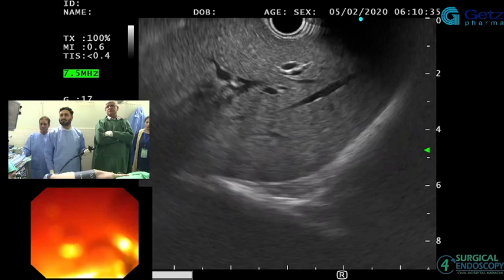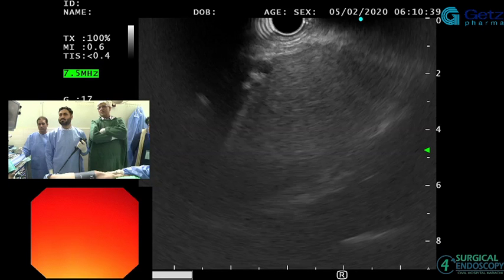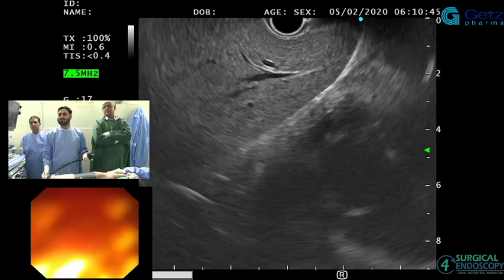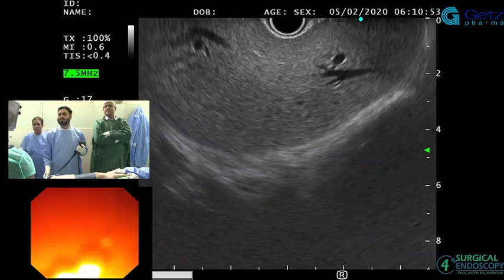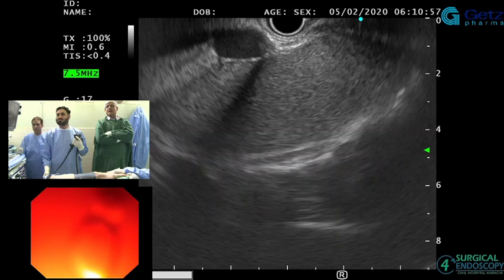So we've got liver, right? So you've got tip up, right? Jahan pe aap pehle the, that was nice, right? Just advance your scope a little bit. Dr. Saad, can you hear us? Yes, I can hear you. Sorry, we couldn't hear the history. Okay, 48-year-old lady with distal CBD stricture, ERCP done, stent placed, CT scan not showing anything.